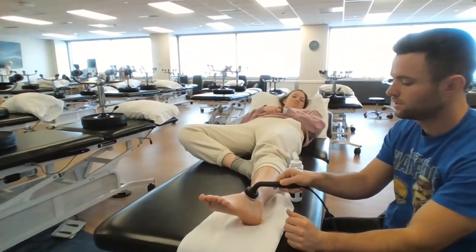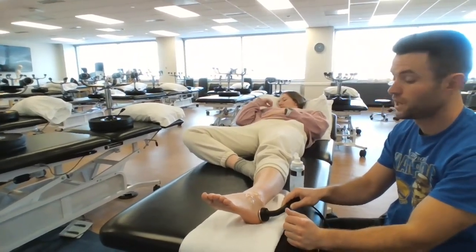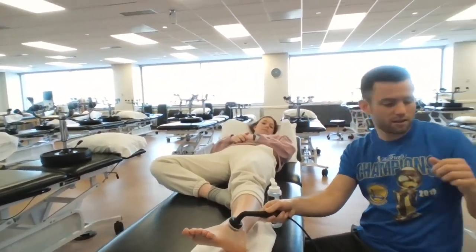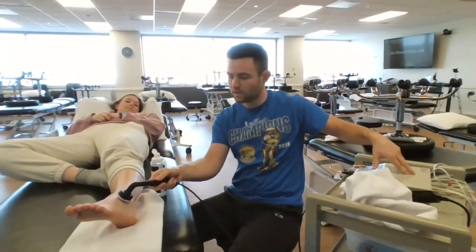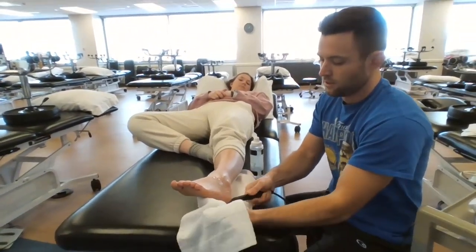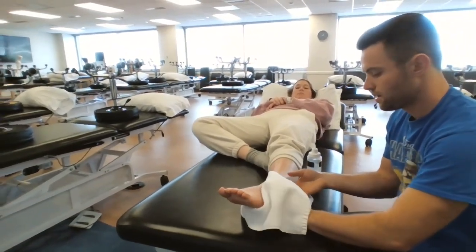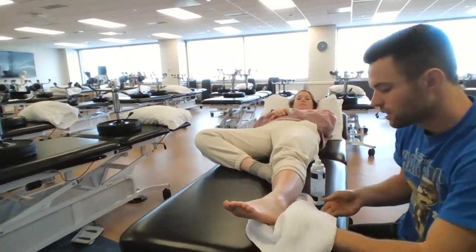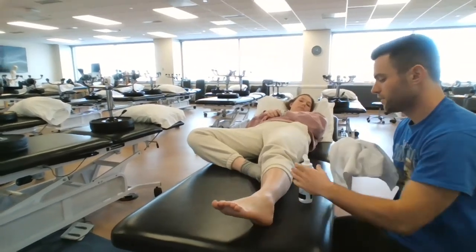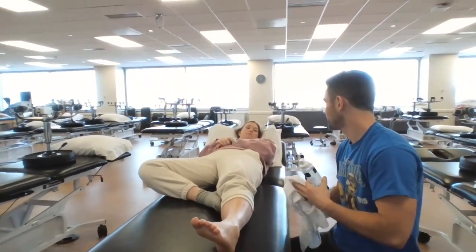How are you feeling? Is this hurting anything? No? Great. Okay, we're going to pretend the 8 minutes is up. So we're going to go ahead and keep that head on there, turn the machine off. Lift it up. Wipe this head off. Wipe the ankle off. Okay, your skin still looks okay. How you feeling, Ronnie? Good. You ready to move on to our next activity? Great. Let's do it.